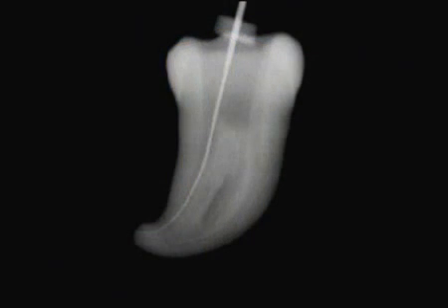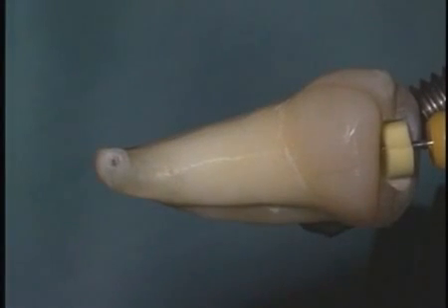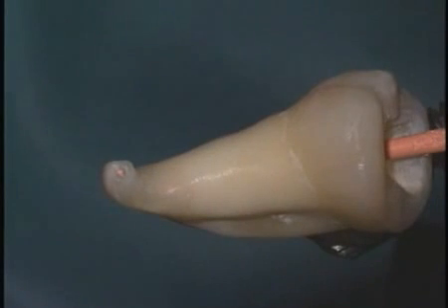Let's look at the evolution of a Type 1 transportation. Initially, smallest flexible files can feed through the pathway of curvature to the radiographic terminus. However, larger files are stiffer, and trying to introduce them into this abrupt curvature begins to rip the foramen. You can see in this extraoral view that there's space around the file because we've already relocated the foramen. We fit a master cone into these cases, and oftentimes with minor movements, we can manage these cases by just packing them in a traditional way.